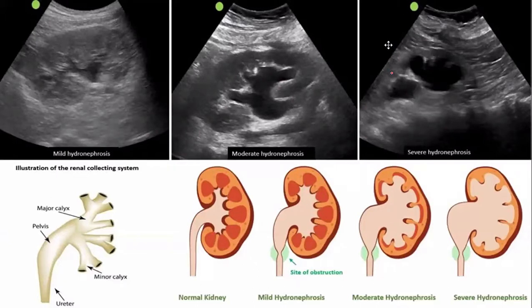This is the pelvocalectasia, if there is an obstruction already. Whatever the cause of the obstruction, this is the pelvocalectasia, synonymous with hydronephrosis. It could be mild, moderate, or severe. This one is urine. The black thing that you see is the urine.